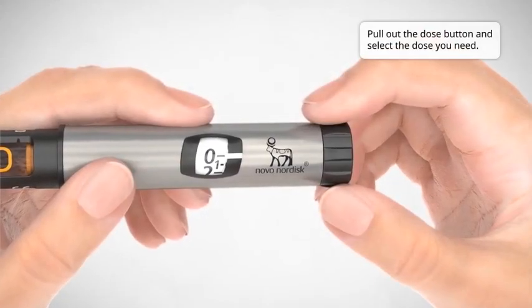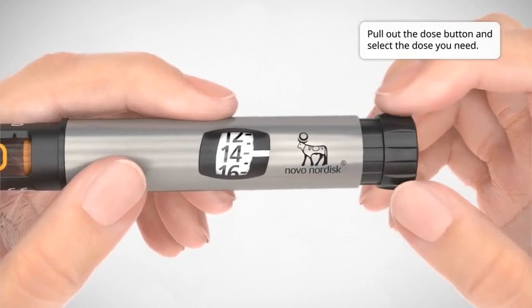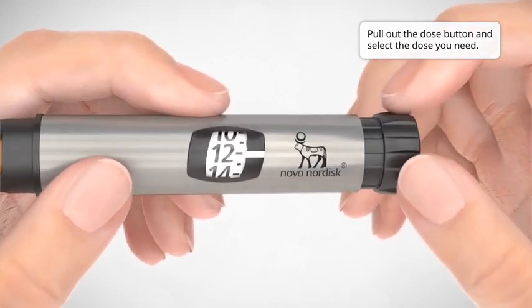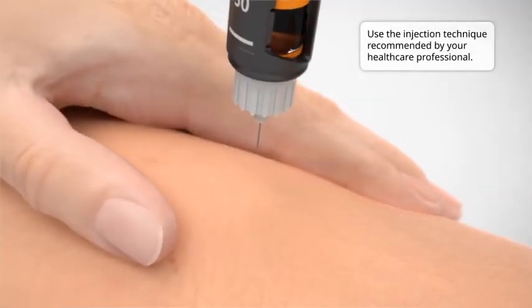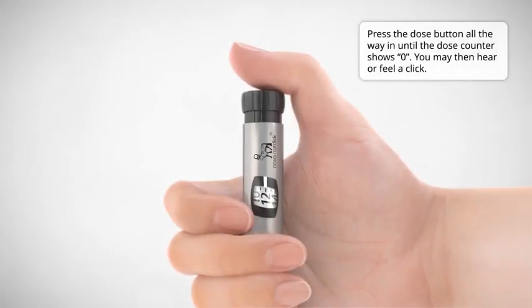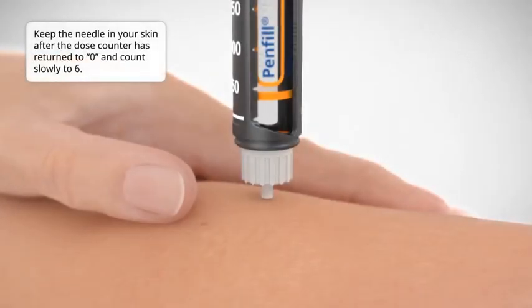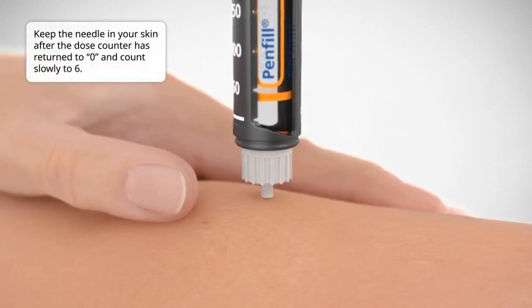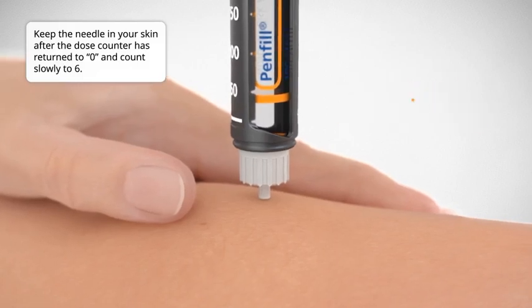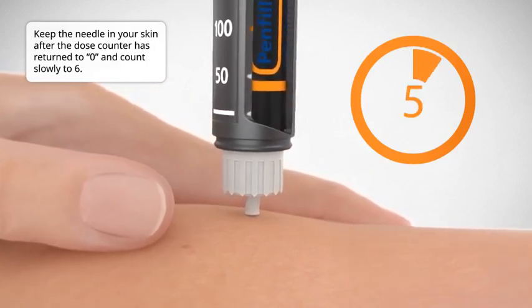To select a dose, pull out the dose button and turn it to select the number of units you need to inject. Adjust the dose by dialing forward or backward if necessary. To inject the dose, lift a skin fold, insert the needle into your skin, and press the dose button all the way in until the dose counter shows 0. You may then hear or feel a click. Keep the needle in your skin after the dose counter has returned to 0 and count slowly to 6. This ensures you get your full dose. Wait and count slowly. 1, 2, 3, 4, 5, 6.